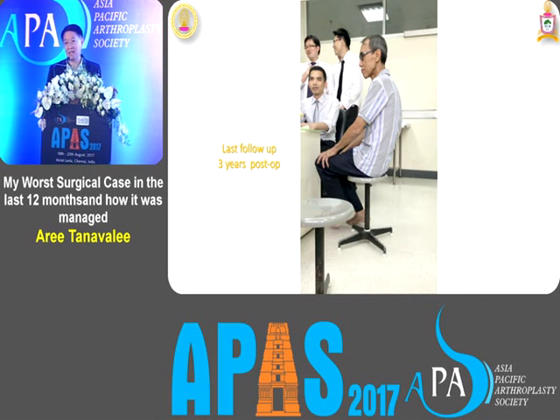And for the acetabular side, we found that 5 years later there was cup loosening. So I believe that at the beginning, there was no clear bone ingrowth. This is why currently, when I use a cup, I go to a more porous material. This is the lesson learned for me. Thank you.